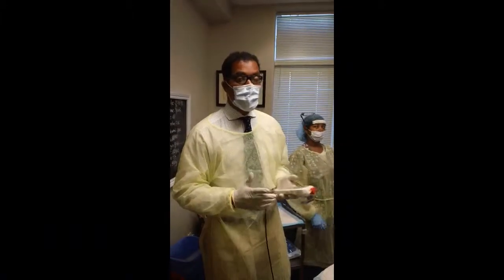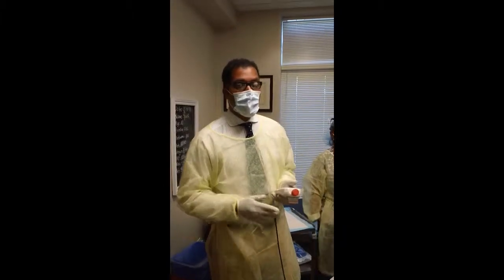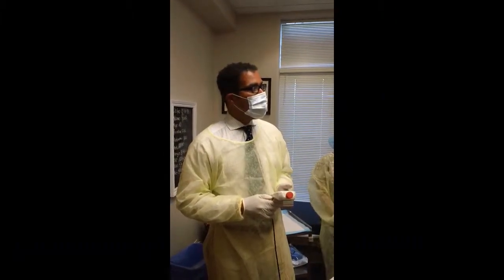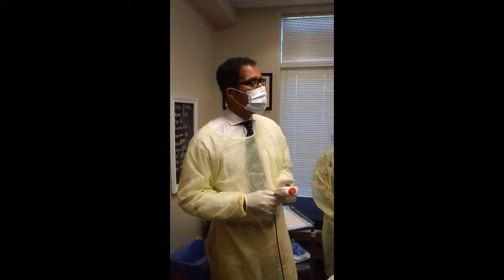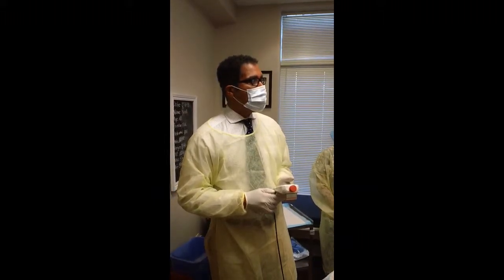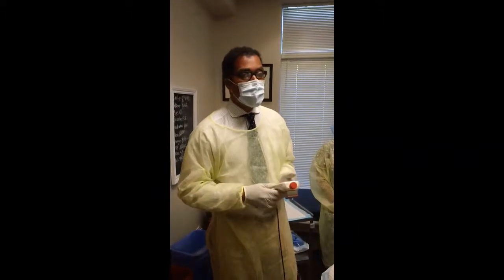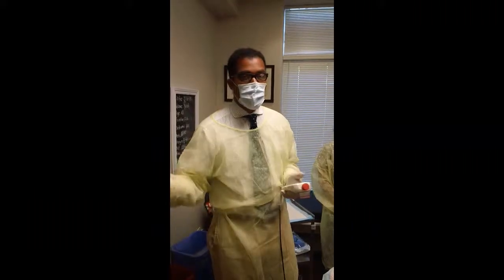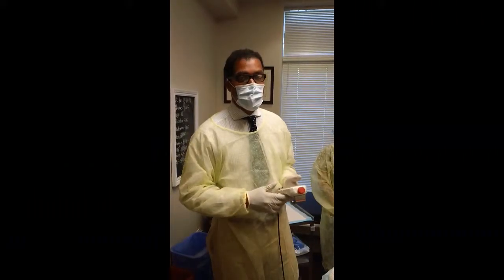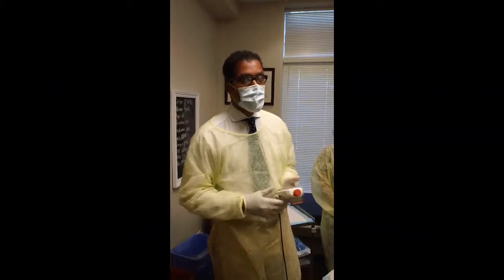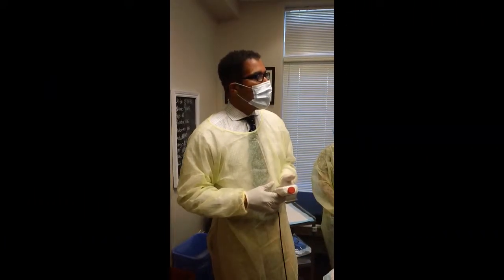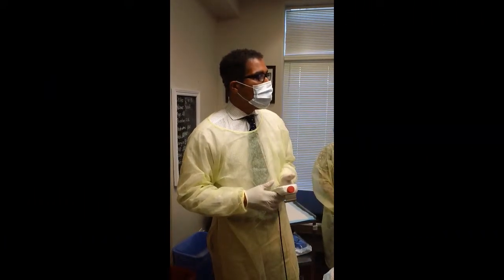Hey, this is Dr. Yates. We're doing an ARTAS patient on an African-American patient with fairly curly hair. I know you hear the music playing. We do everything with music, but it's working well.